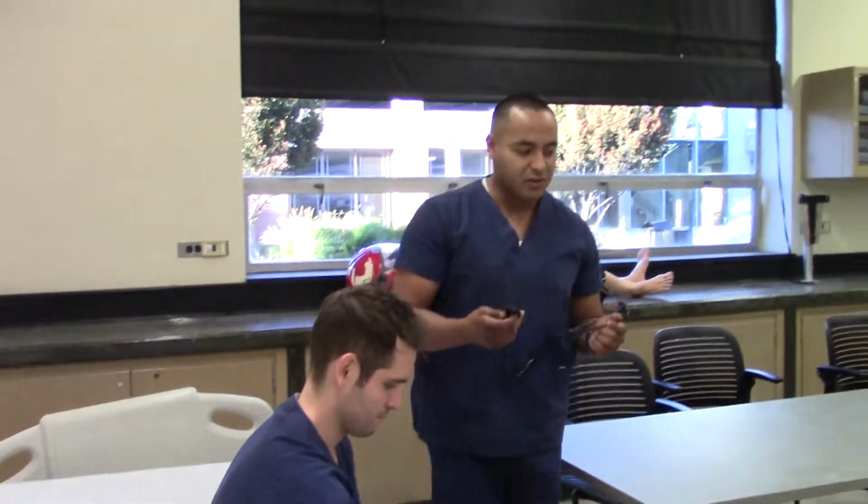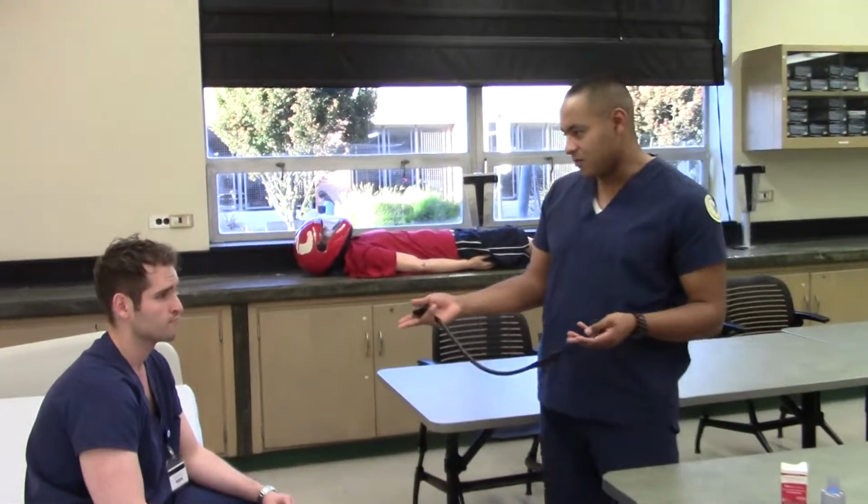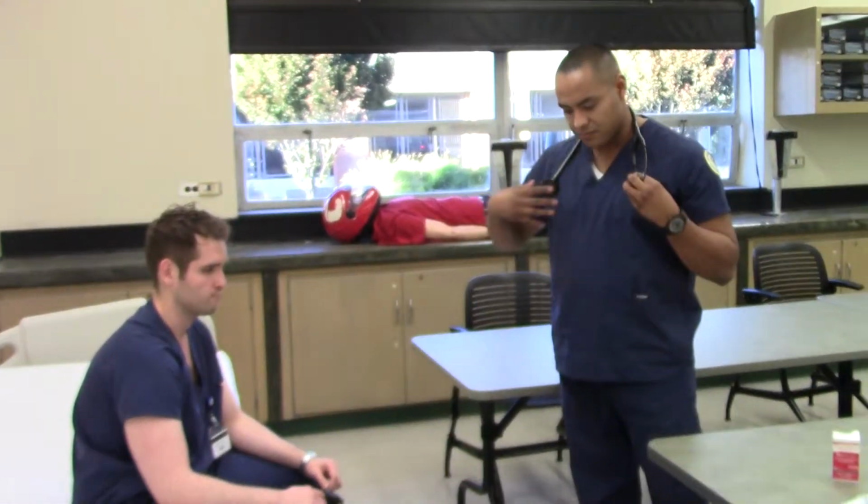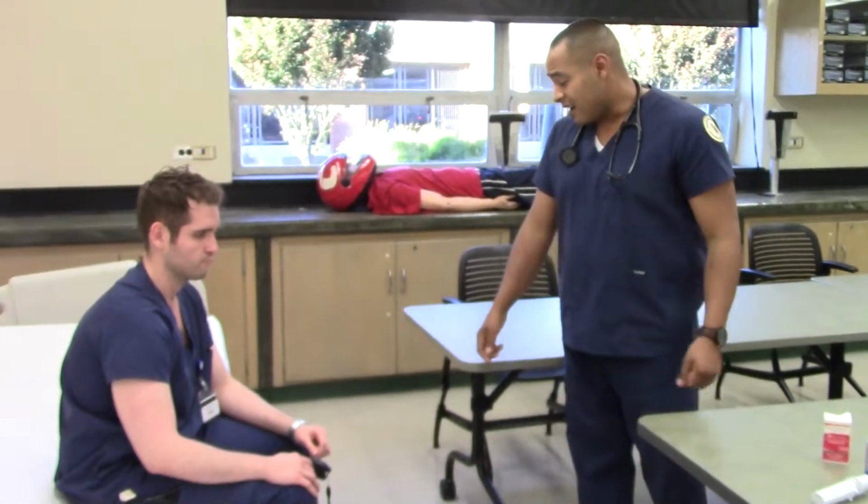Make sure when the patient breathes in, you want to see it. You want them to do the full tidal volume. So you get the full exhale, inhale. So this patient, he's heard wheezing, right? If he's having trouble, it's indicated, right? Wheezing at the lungs, almost at the bases of the lung, not the top.